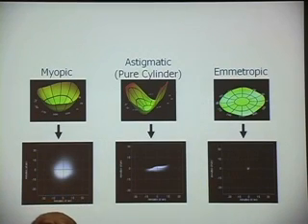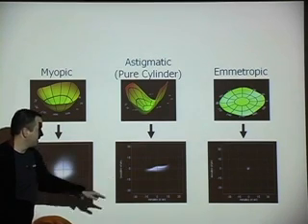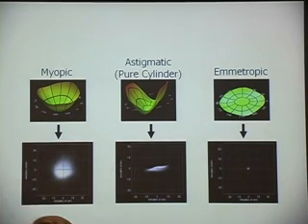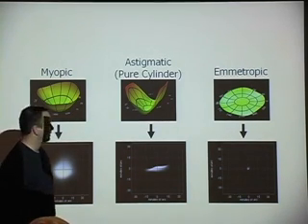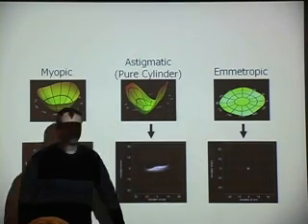Here are some real simple cases. A person who's nearsighted sees a fuzzy blob. A person with astigmatism, so that's nearsighted on one axis. This other axis, it's a fairly well-focused mark, but along here you have significant blurring. So if there are lines that are running this way, it looks pretty sharp and in focus to them. But a line running this way will not be in focus. Here's our emmetrope again. This guy sees pretty well. Even he doesn't need glasses, has good vision. There are some ripples, and you can see some of the effects down there, but they're small.